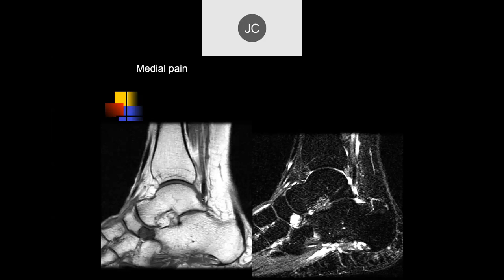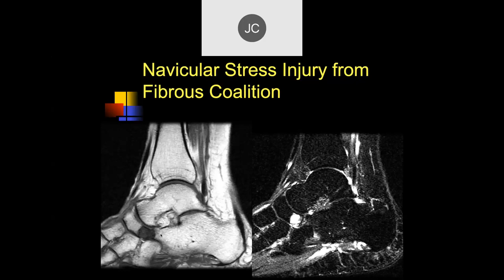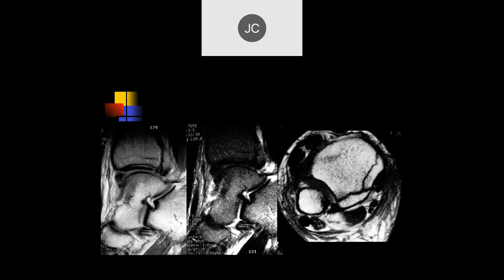This case shows a calcaneonavicular coalition — one of the more common coalitions around the ankle. This was a fibrous coalition, which produced increased stress on the lateral aspect of the navicular. The coalition limits normal motion and generates abnormal stress on surrounding bones, contributing to a painful condition that may require immobilization.